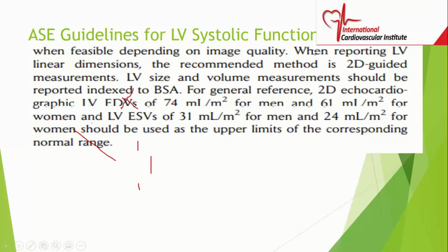When you're reporting LV size using linear dimensions, the recommended method is 2D guided measurements. And the LV size and volume should be indexed. So you have to know what's recommended. When you're reporting the LV size and volume, it should be indexed, so whatever value you get, you divide it by the body surface area.